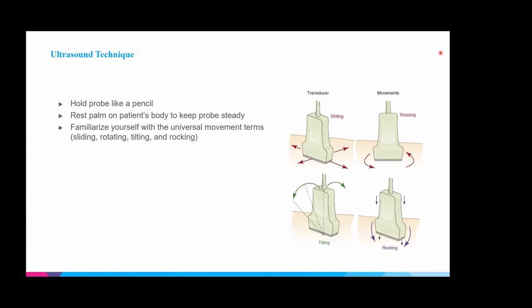And then you want to use the aspect along your pinky, of your palm, to steady yourself as you're moving the probe along the patient's body. So these terms to the right: anytime we want you to move the probe on the same plane as the body surface, that's called sliding. Whether we want to slide the probe up or down or to the right or left, notice your angle and contact with the patient remains the same. So that's what we call sliding.